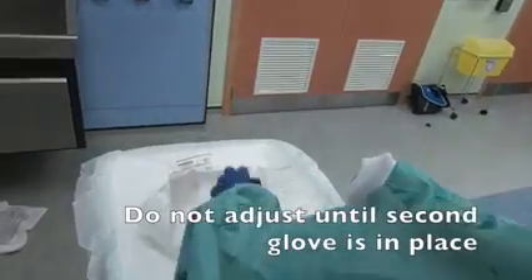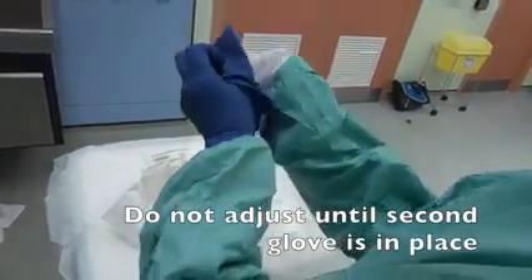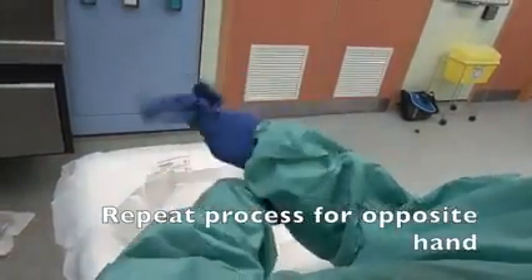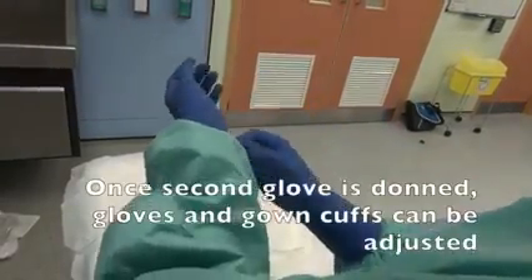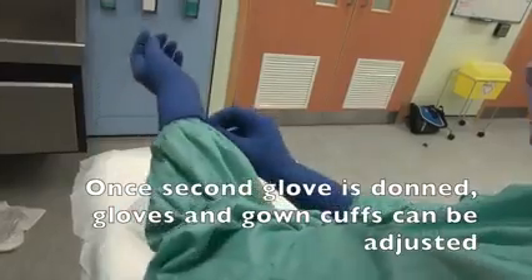Do not adjust until the second glove is in place. Repeat the process for the opposite hand. Once the second glove is donned, gloves and gown cuffs can be adjusted.